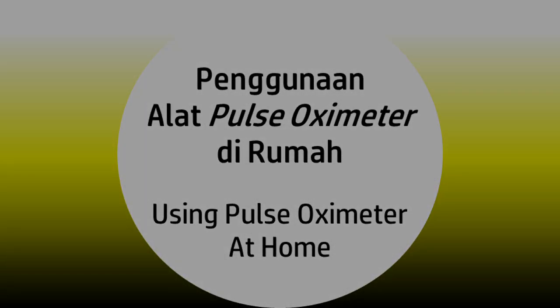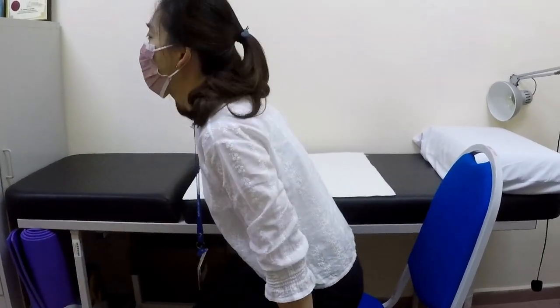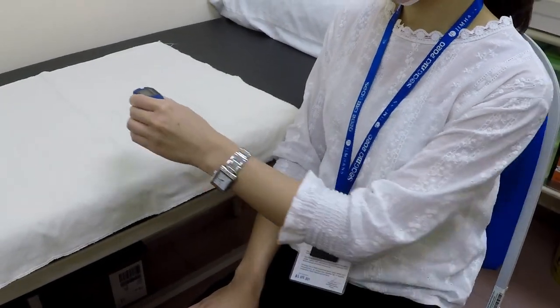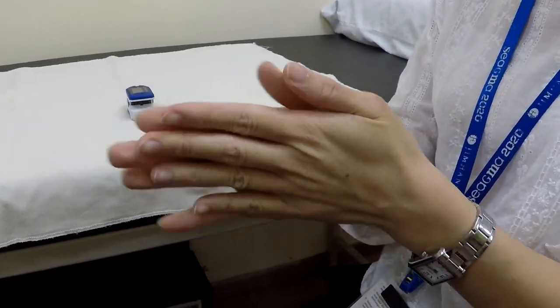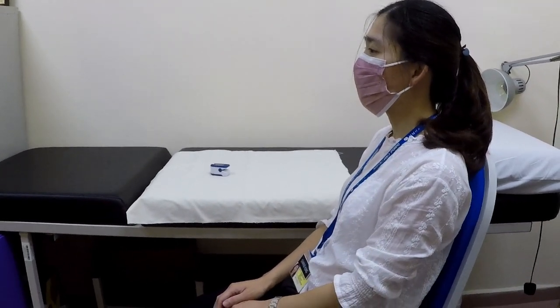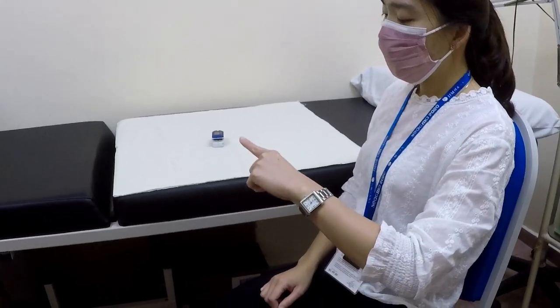This video will demonstrate how to use a pulse oximeter device at home to measure oxygen saturation. Warm your hands if cold. Rest for at least 5 minutes before taking your measurement. Rest your hand at the level of your heart and hold it still.